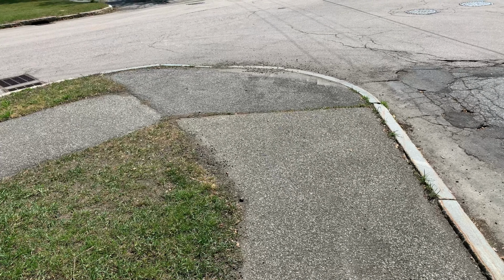And another cue I can use here is at the end of where it blends in the street, there is a curb that is flush with the corner and the street, but it has a little bit of a tactile difference underneath my cane tip. So when I'm traveling, I can use my cane tip and feel the slope down, as well as the blending into the street and the little curb, which has kind of a tiny little lip. But if I'm looking for it or paying attention for it, I can hopefully find that.